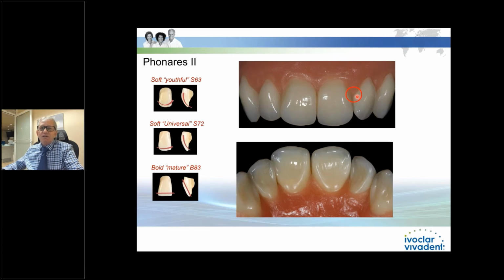It is very natural. If this was a regular tapering tooth or an ovoid tooth, I would have to bring my wax all the way up here to the contact point. That's not natural. You don't have tissue coming all the way up to almost a third of the tooth. It's just not natural. So that's why I like these. They make me look good. I can be a very poor technician, but these are going to make me look good. That's sad to say, but the materials, the teeth, and the acrylic make or break a laboratory technician. Makes them look good or makes them look bad.